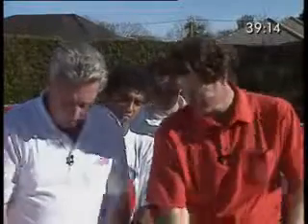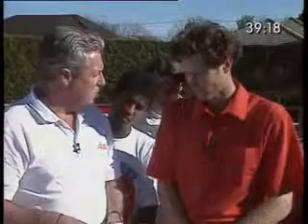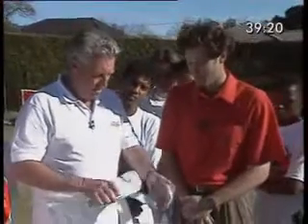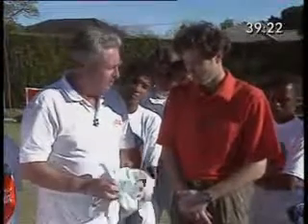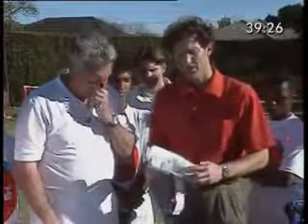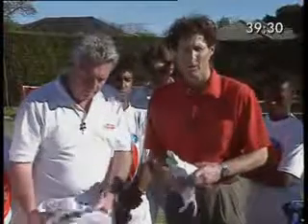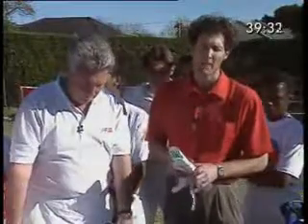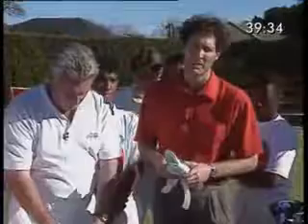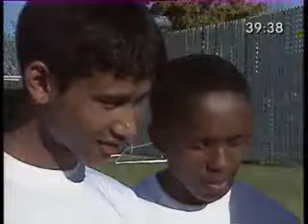I see here, Craig, that we've also got an ankle brace, which I suppose if you do have a twisted ankle, it'd be nice, if you haven't got strapping, to compress it as quickly as possible. That's correct. In the event of an ankle injury, the ankle brace can be used and applied to help the cricketer walk home thereafter and have stability. Or if the player is recovering from an injury 2 to 3 weeks thereafter, he can use the ankle brace as a form of his rehabilitative therapy.